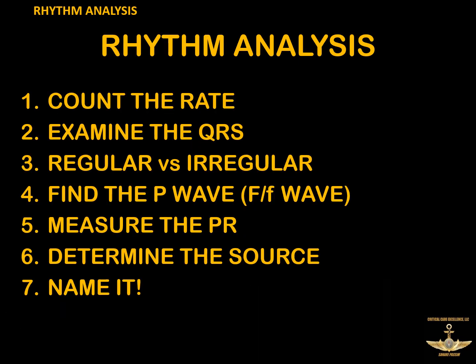So that brings us to the important part, which is actually how to assess and analyze the rhythms. Most important thing about this is that you have to have a systematic way to do it. In other words, you need to look at rhythms the same way every single time. As you do this for testing, this becomes important because a lot of these rhythms will look the same until you go through this process and dig into them a little deeper.